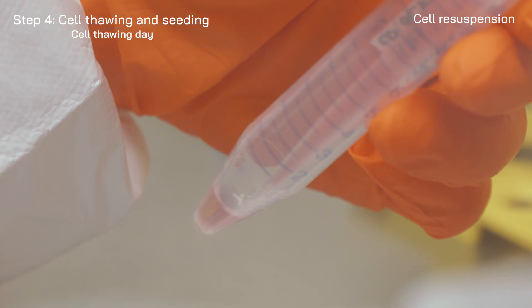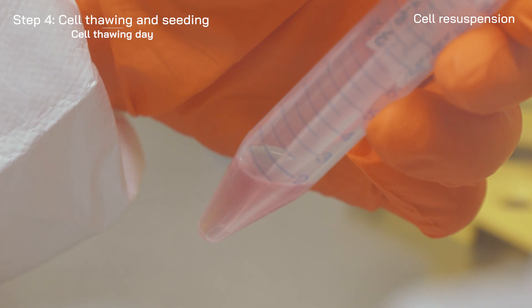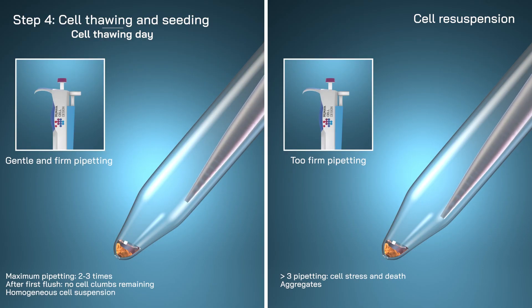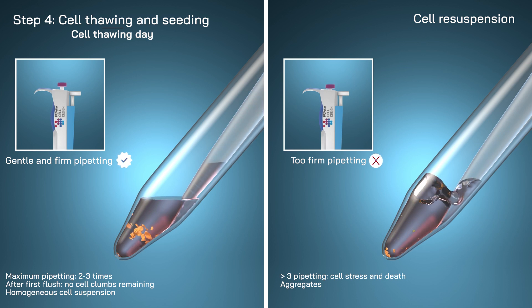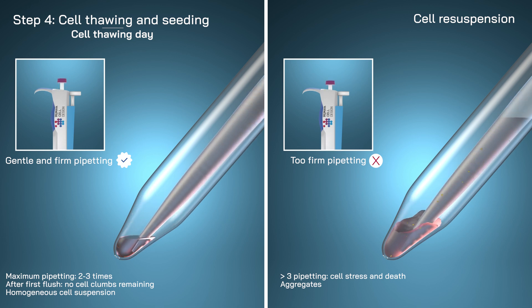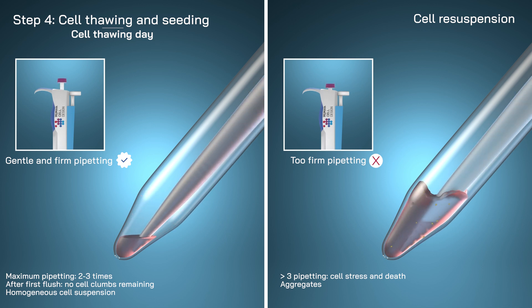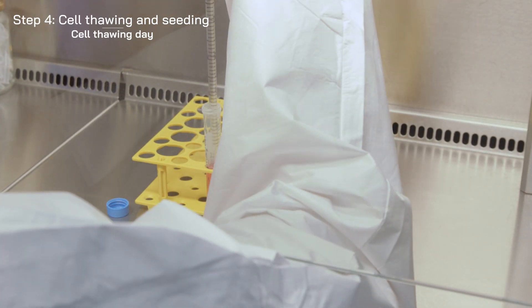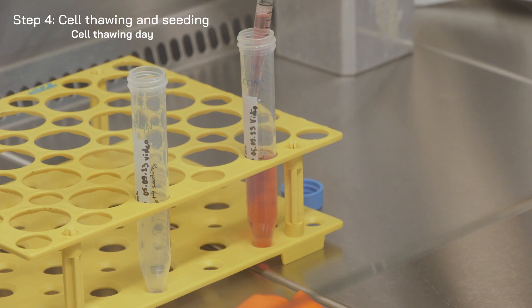Gently re-suspend the cell pellet by pipetting a maximum of 2 or 3 times. The initial rinse should be gentle but firm enough to dislodge the pellet. After cell counting, add medium to get the appropriate cell concentration and proceed to seeding.